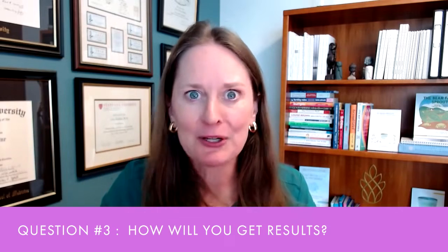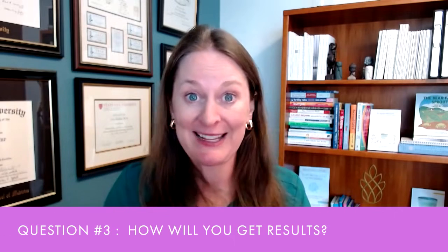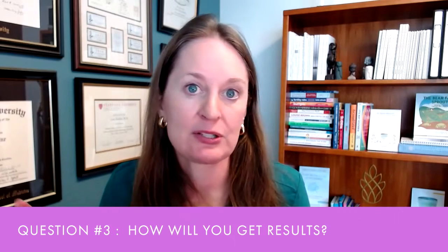Question number three, how are you going to get results? Are you going to get results right then and there? When patients do hysteroscopy and saline sonograms, all tests, we talk to patients about the results right then. We often will say, hey, I'm going to review this with your primary doctor, but this is what I saw today, and we'll make sure and follow up with you in the next couple of days. But we try to give immediate results because we know you want this information.